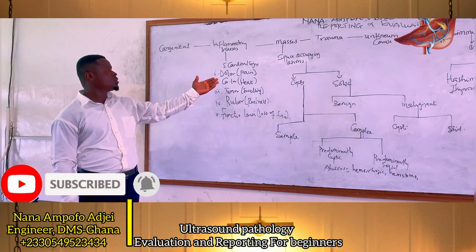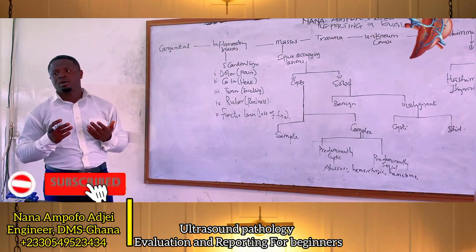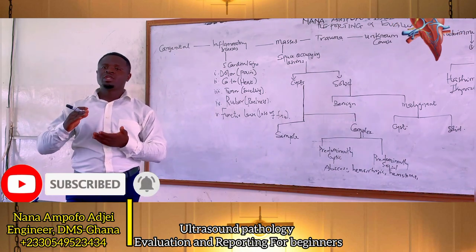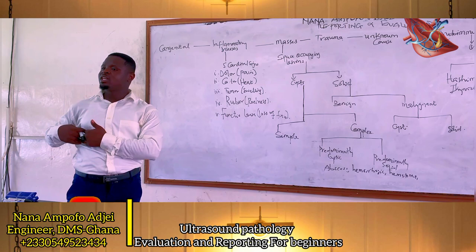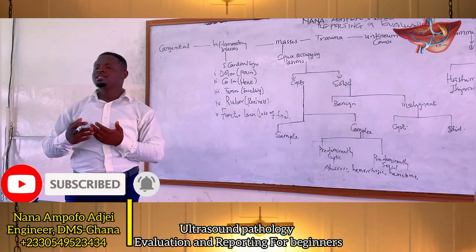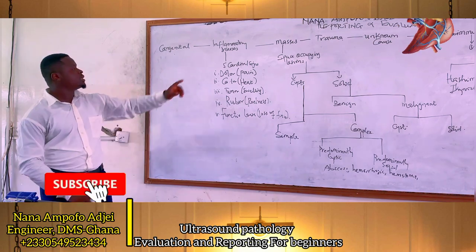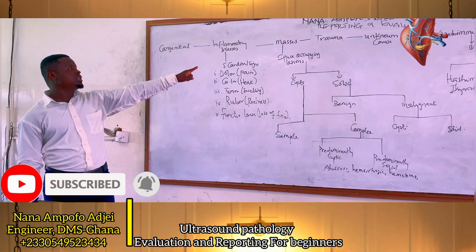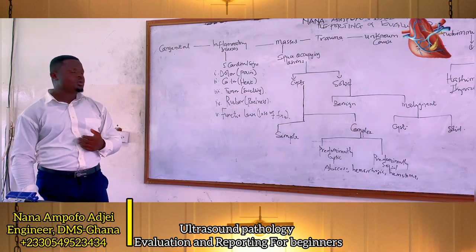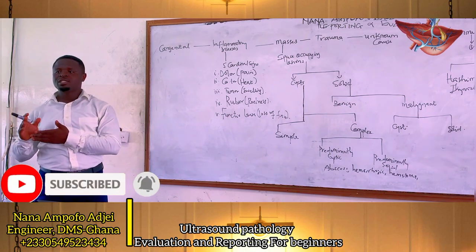Okay, so one sign is what? Pain, dolor, and then heat. Okay, in sonogram or in ultrasound, we talk about a rising temperature. So the patient comes to you with right upper quadrant pain. So first sign, right upper quadrant pain, and then rising temperature, heat, fever. Okay, that gives you a clue that what you are likely to see on the sonogram is likely from inflammatory origin. Right breast pain, mastitis. So inflammation of the breast tissues.